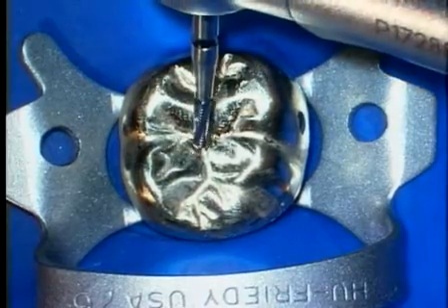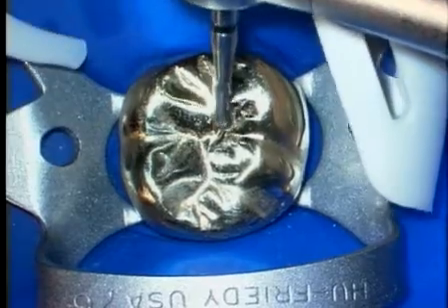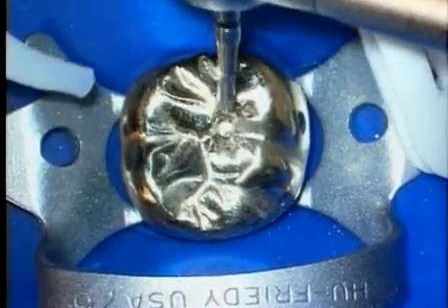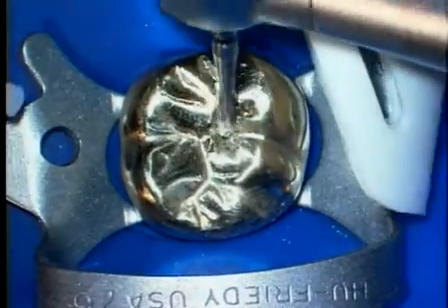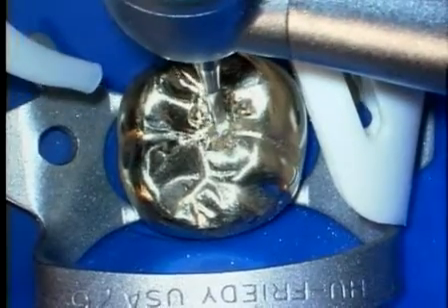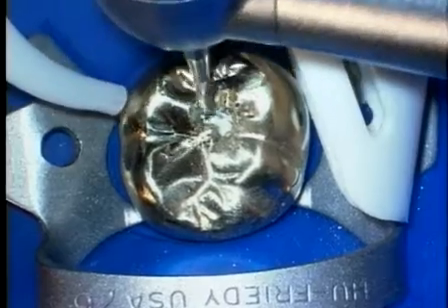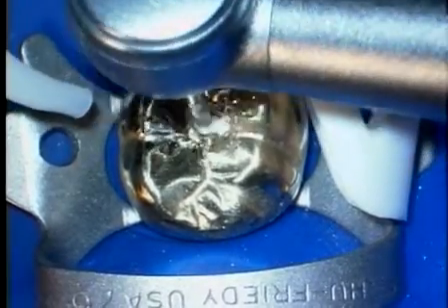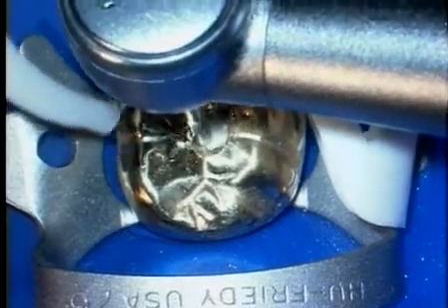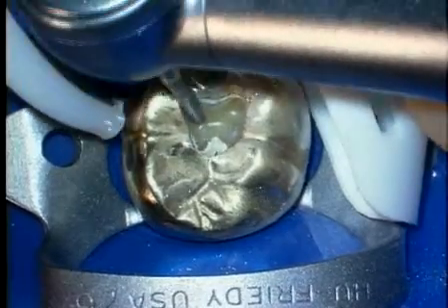Since we're preparing an access window through a metallic crown, we use the transmetal burr. Lay the head of the handpiece over to get it out of your line of sight. Try to penetrate through the gold as quickly as possible. Transmetal burrs, when they're used on their ends, skip and they dance, so try to cut through the metal so you can use the side of the burr. The side of the transmetal burr has a special sawtooth configuration that reduces vibration and rapidly removes metal. Use the transmetal burr to complete the outline pattern through the gold crown.